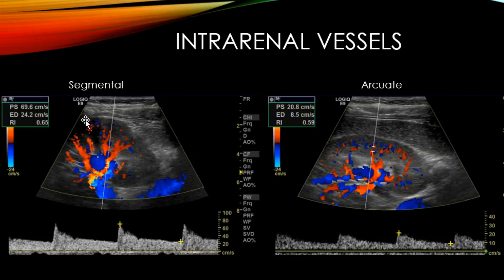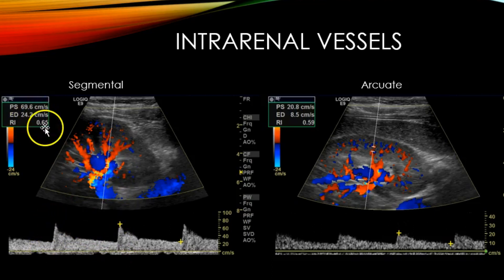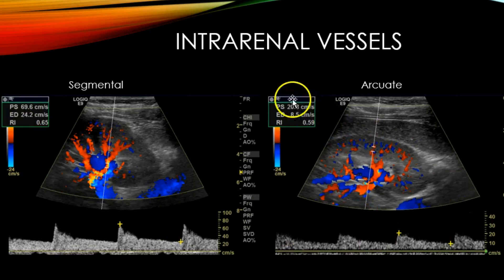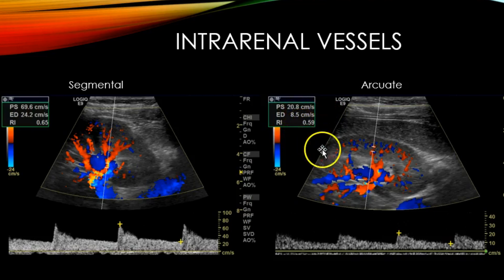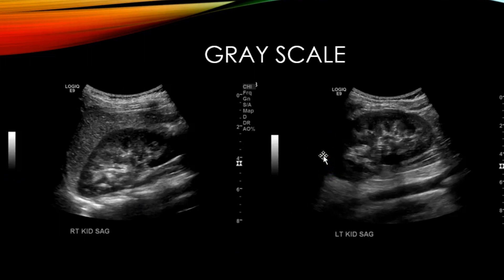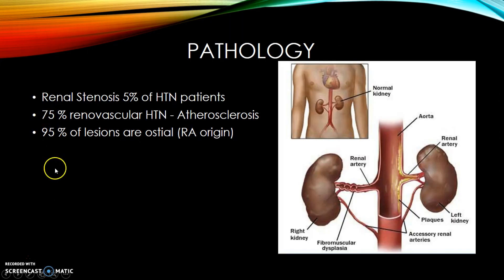For the intrarenal vessels, the AIUM protocol requires Doppler of the segmental arteries at the superior, mid, and inferior poles of the kidney. A normal segmental artery waveform shows 70 centimeters per second with a resistive index of 0.65. As you go further into the cortex, velocities decrease — the arcuate artery shows about 21 centimeters per second with a resistive index of 0.59. Also obtain grayscale images of both kidneys to check for renal asymmetry, masses, cysts, or increased echogenicity.